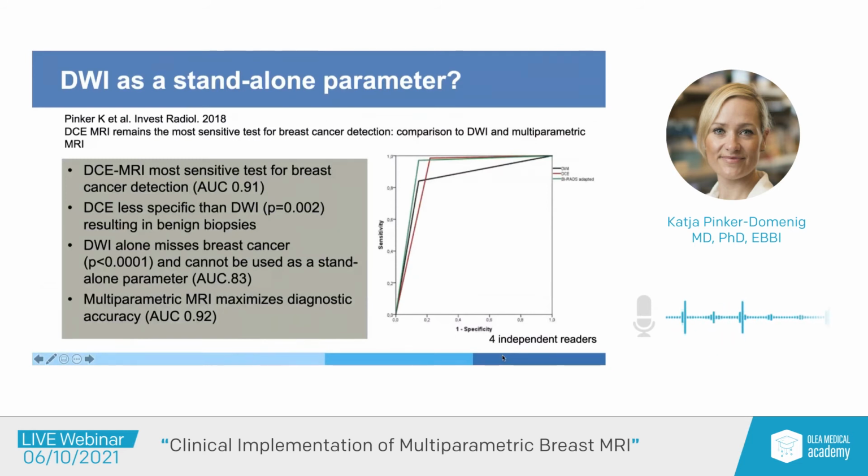Diffusion-weighted imaging is great, and there is a push, as I've said, going towards non-contrast enhanced MRI. We looked at that formally because this is an intriguing question. Can we ditch the contrast and offer our patient the same quality? It depends on what your benchmark is. If your benchmark is the sensitivity and specificity of mammography, you're already there with non-contrast screening. If your benchmark is dynamic contrast enhanced MRI, then you still have a little bit of work to be done, and actually there's active work towards that. The main limitation is currently the resolution we can achieve with diffusion-weighted imaging.